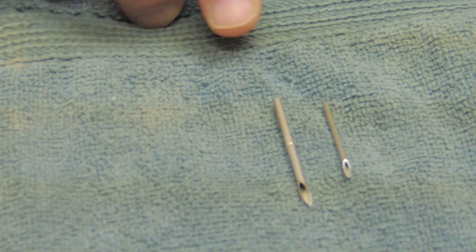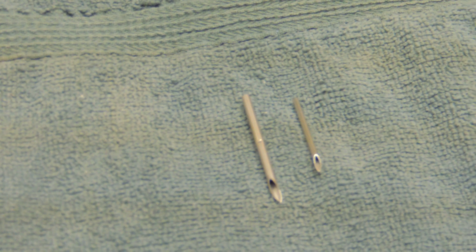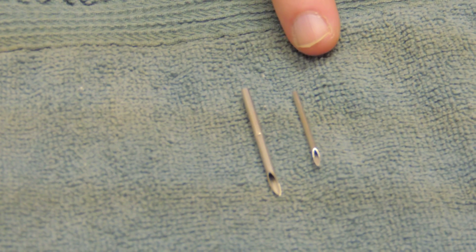So these are the sizes of the old needle, the Avid needle, and our needle. The size of this needle is approximately a 10 gauge and the size of this one is a 15 gauge.